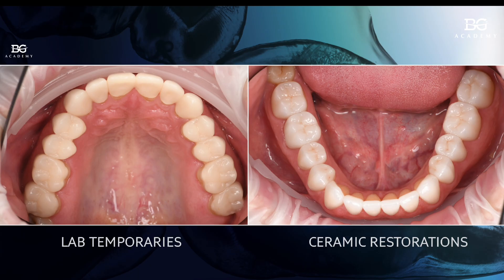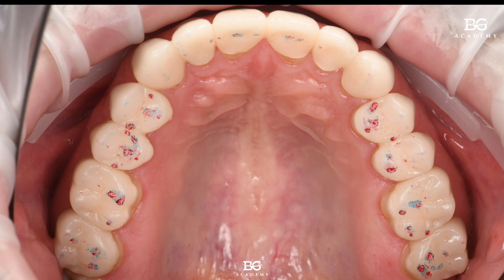So how do we check the occlusion? As everybody does — the lower jaw has the final ceramic restorations, the upper jaw has the temporary restorations. We still have wisdom teeth that we use for our digital protocol for correlation; we will make extractions later on. We use the typical articulating paper, 8 micron — this is my favorite.